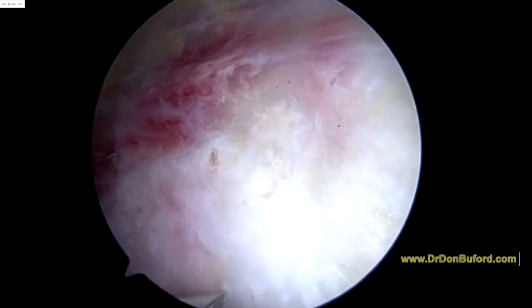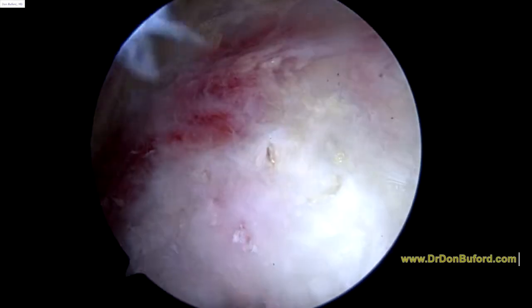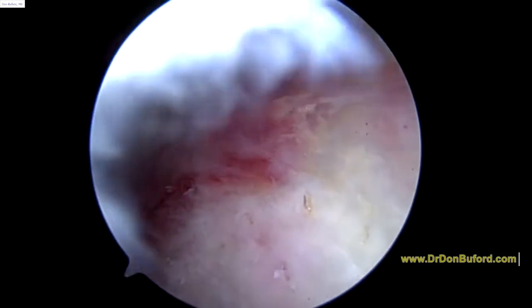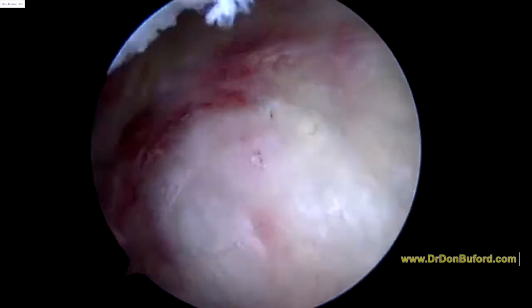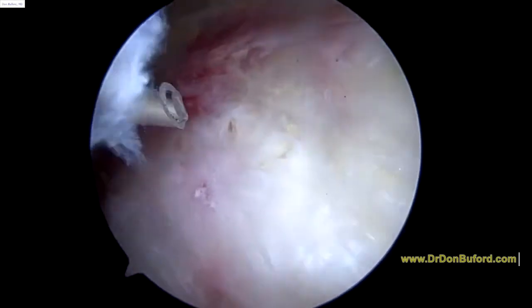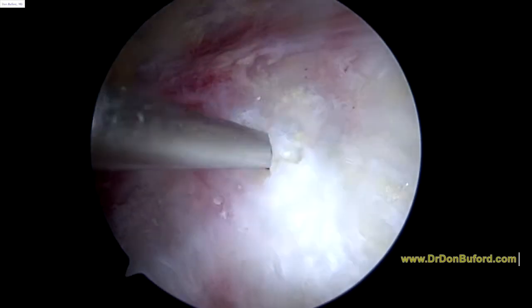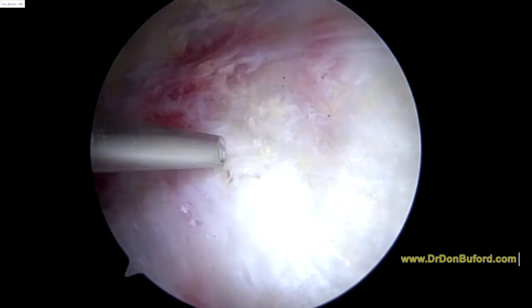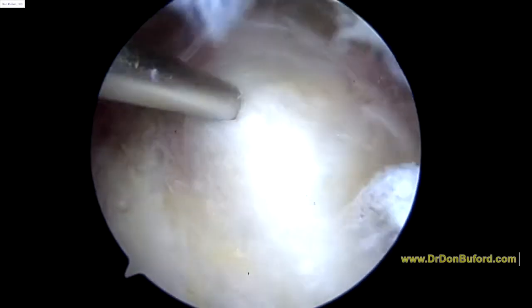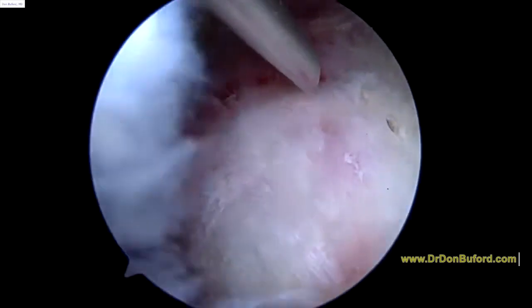I really don't see much — it's a little plate maybe, but nothing that is going to require us taking down the rotator cuff tendon, and that's also good news. I'm going to show you how we check using a needle to bring the calcium out. The cuff itself is certainly intact.